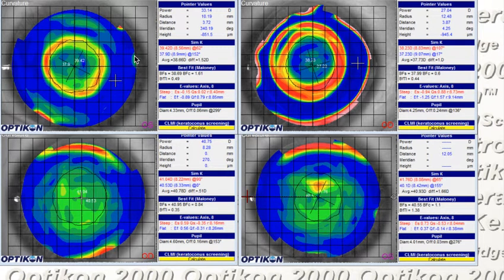In this orthokeratology case, we have a patient whose posterior treatment rings are starting to form. They're well positioned but a little bit faint in both eyes, not very complete, but will probably improve over time.